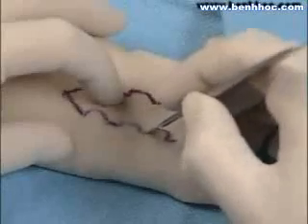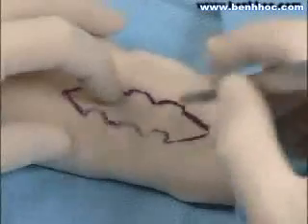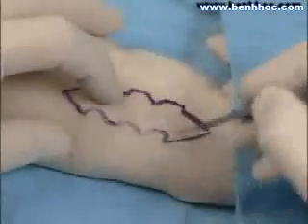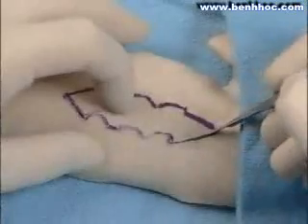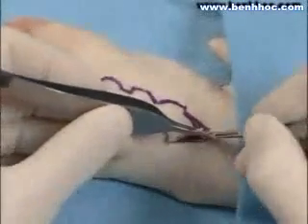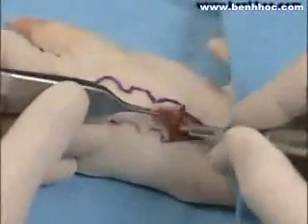The geometric broken line closure is really designed so that each side is a mirror image of the opposite side. Because of the toughness of the pig's skin, the geometric shapes here are accentuated, certainly larger than what we would perform on a human in scar revision technique.